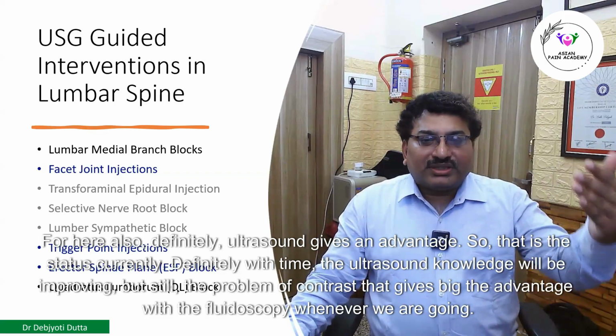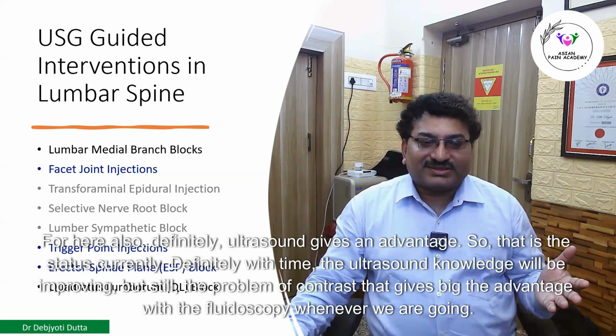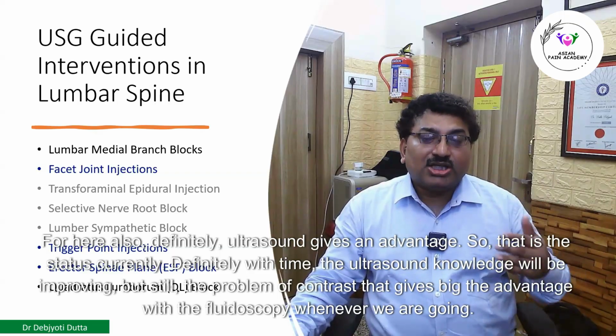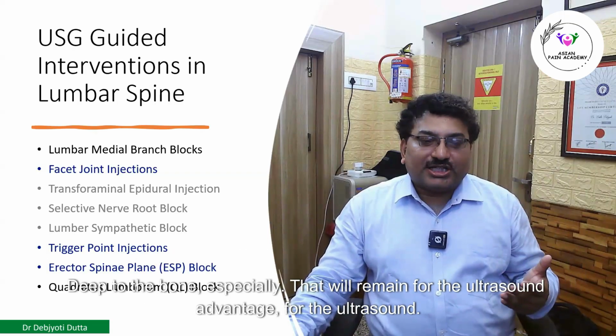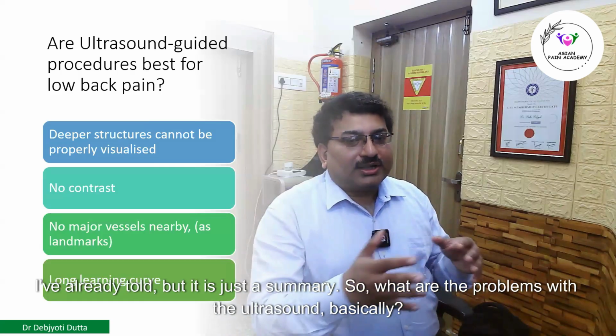Definitely with time, ultrasound knowledge will improve, but the problem of contrast, which gives a big advantage to fluoroscopy whenever we are going deep to the bone especially, will remain a disadvantage for ultrasound. Now, I've already told you, but it is just a summary.